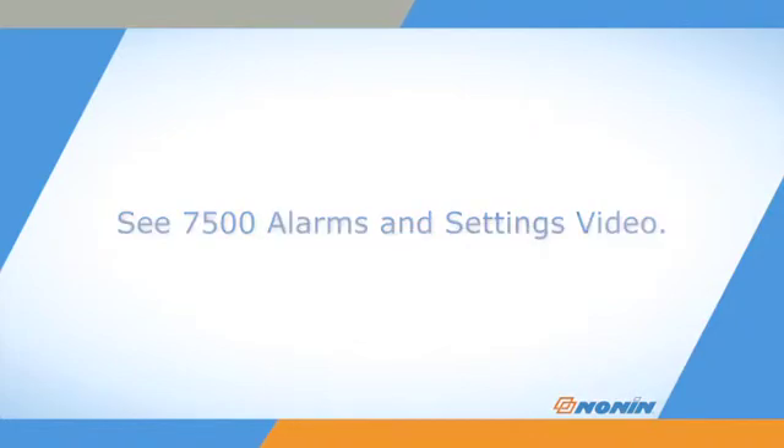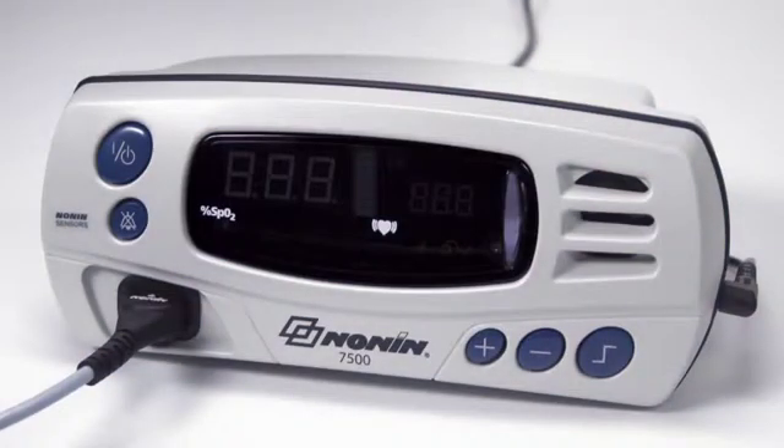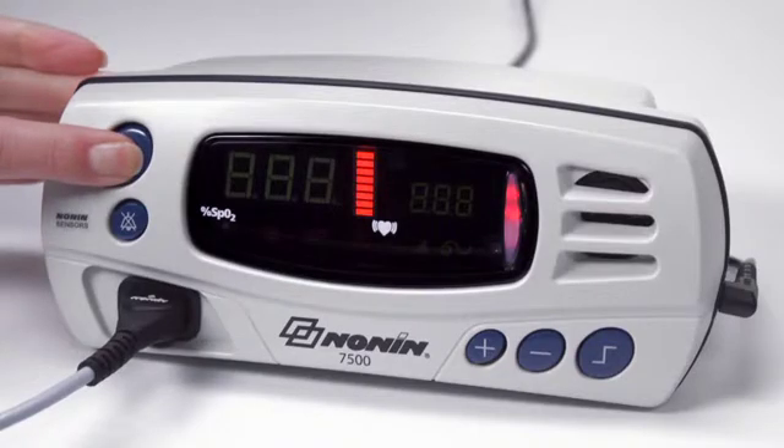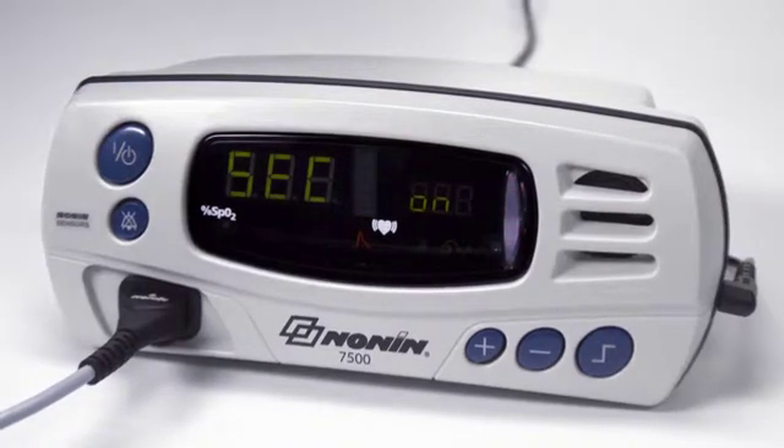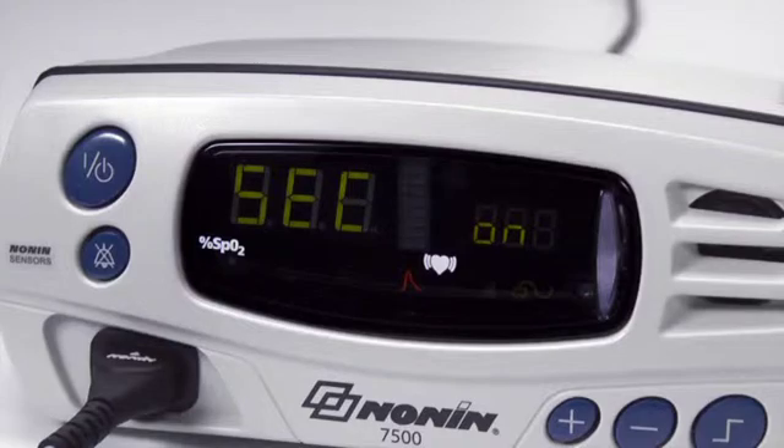A patient security mode may be set to prevent changes to alarm limits and a number of alarm and functional settings. When the Model 7500 is turned on in patient security mode, SEC ON is displayed in the display area and 3 informational tones sound.